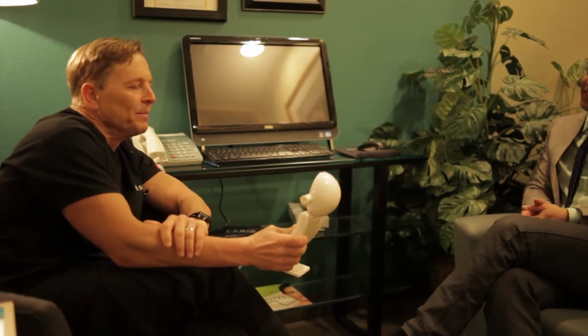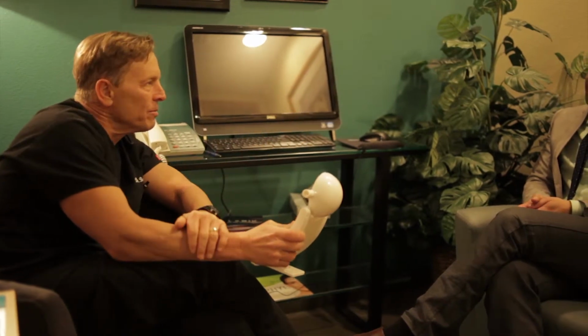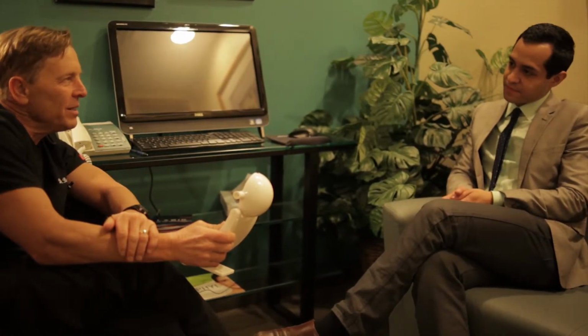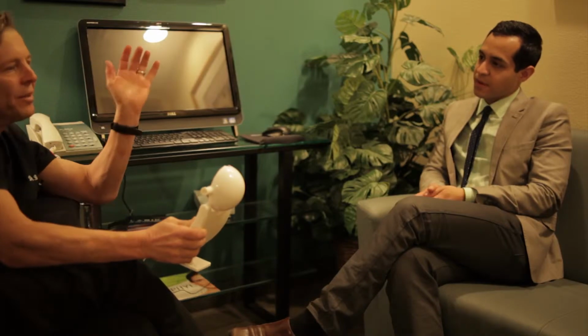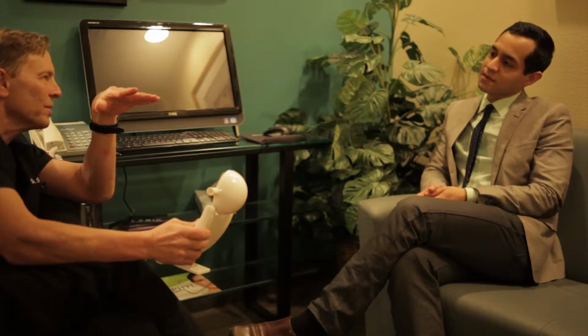I'm 25. So at 25 years old, we tend to push you more toward what's called advanced surface ablation. The reason is because we don't like placing an incision in your eye and weakening the cornea. You have a long life ahead of you. The tissue in a younger person tends to be less rigid than tissue in an older person. LASIK we tend to use on people that have high prescriptions or older age that would take longer to recover. Younger people with lower prescriptions do great with advanced surface ablation. It's basically a much less invasive procedure.